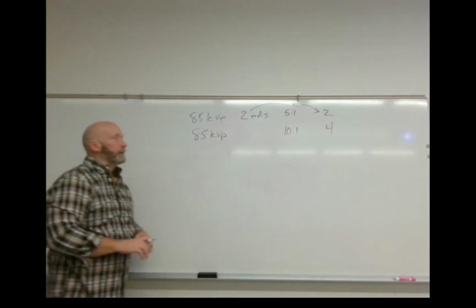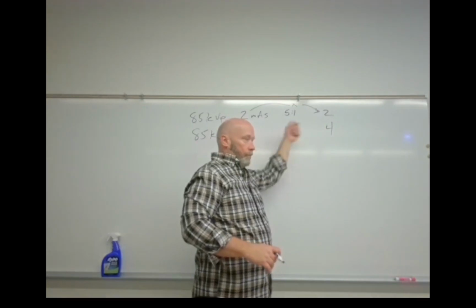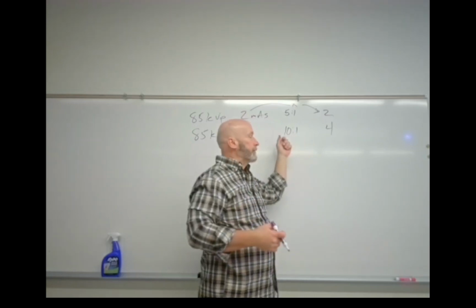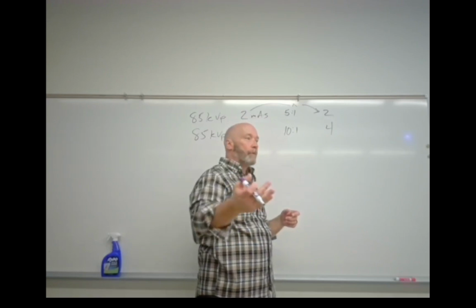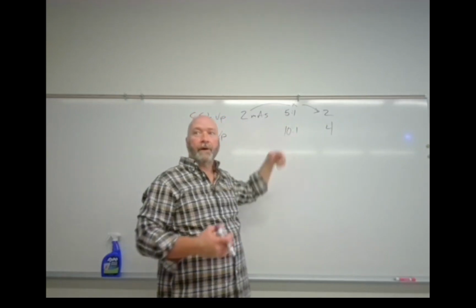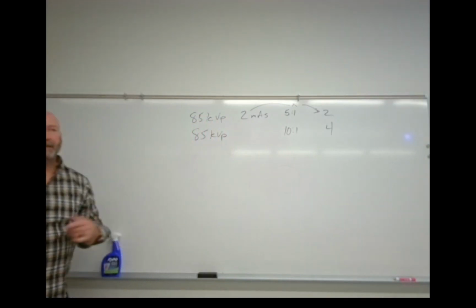Right, right. So then what you've got is with a higher grid ratio, you got more lead, you got more cleanup, it's going to clean up more scatter radiation, you're going to need more mAs. So as you change your grid ratio from a lower to a higher grid ratio, you're also going to have to increase your mAs. Okay, so you can do this in a couple of different ways.